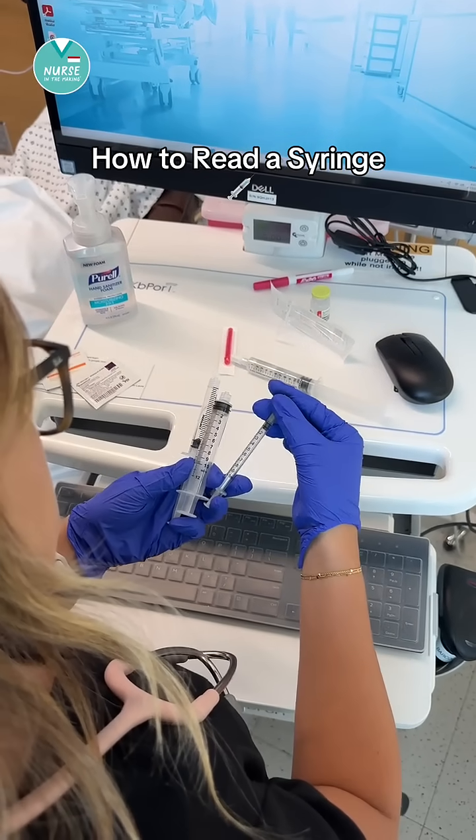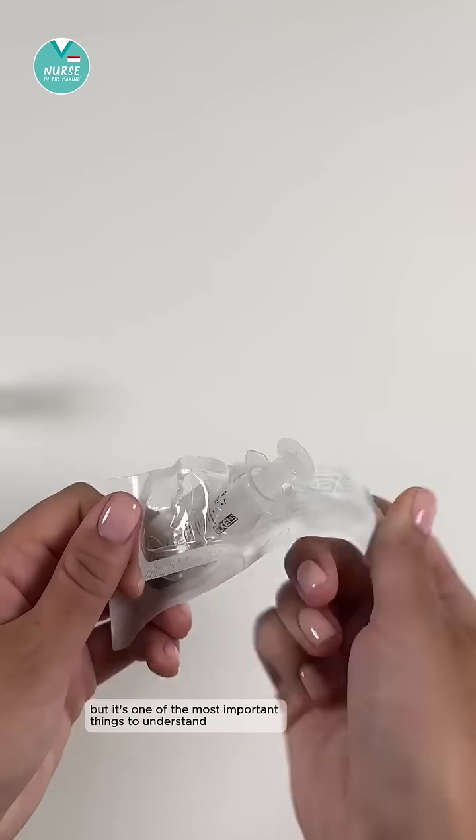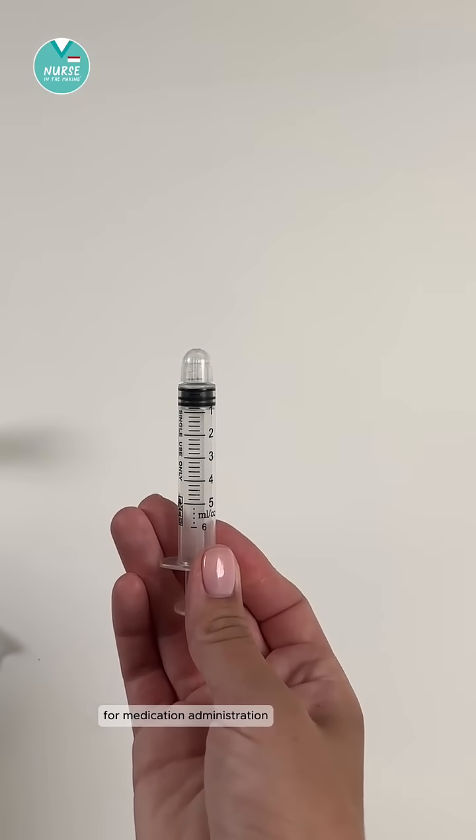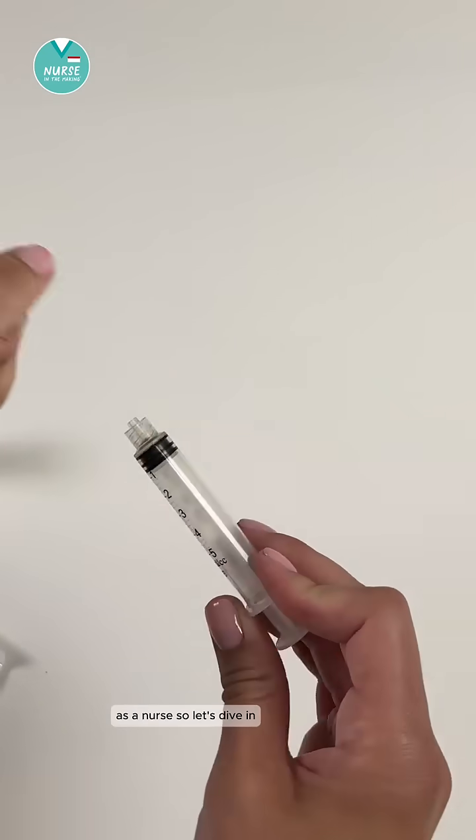Let's go over how to read a syringe. This might sound silly, but it's one of the most important things to understand for medication administration as a nurse, so let's dive in.